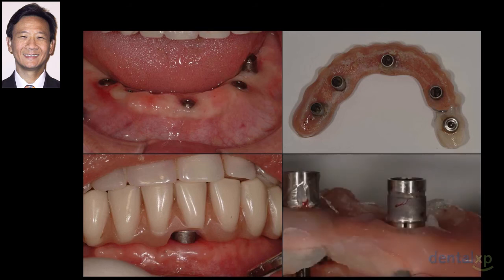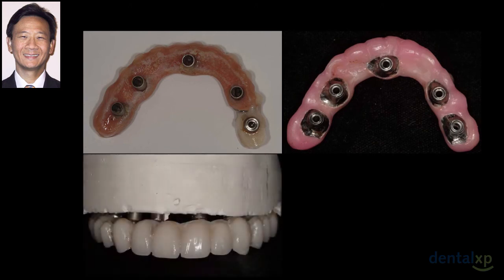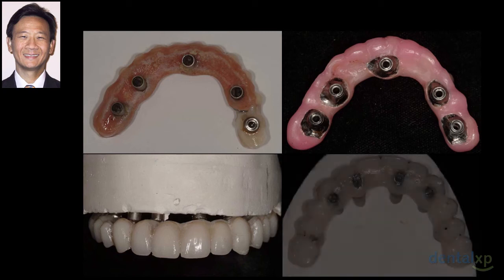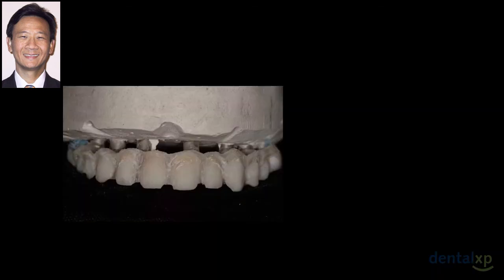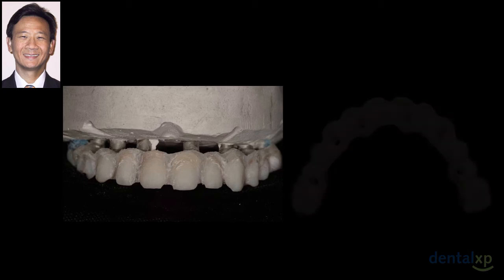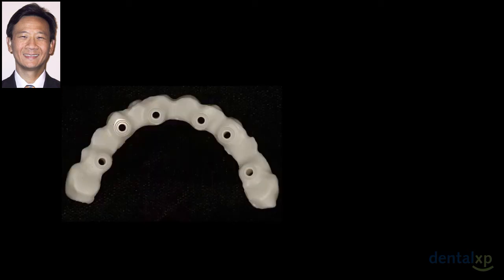We made the prosthesis on the mandibular arch in a titanium framework with acrylic resin teeth. And in the maxillary arch, we did a little something different, and that was to use a zirconia framework. This actually was a resin scanning index that we were able to try into the patient and evaluate tooth positions, incisal edge positions, and the occlusion. We then cut back this acrylic resin scanning appliance to make space for the veneer and porcelain. But we left all the occlusal surfaces and the first molars in a solid zirconia position, where the occluding surfaces were all in 100% zirconia.